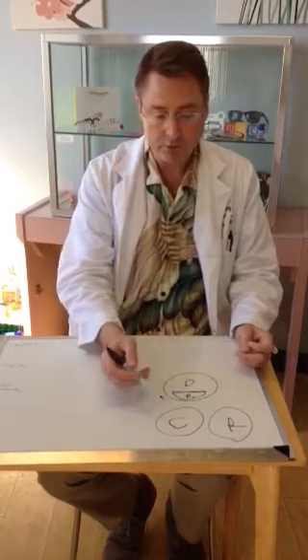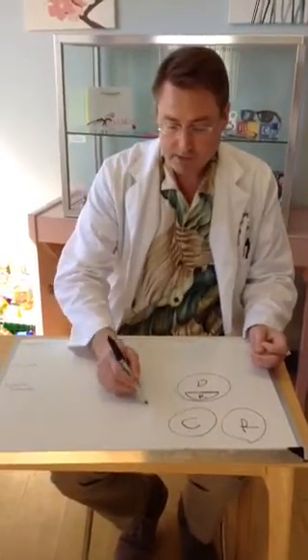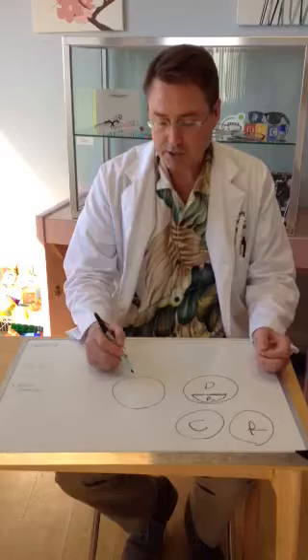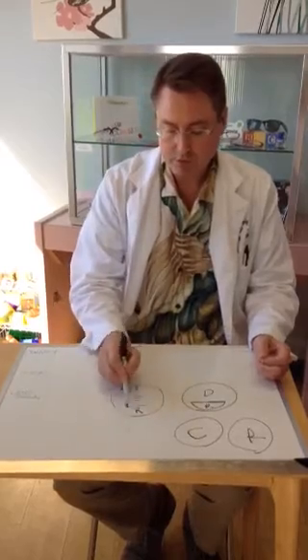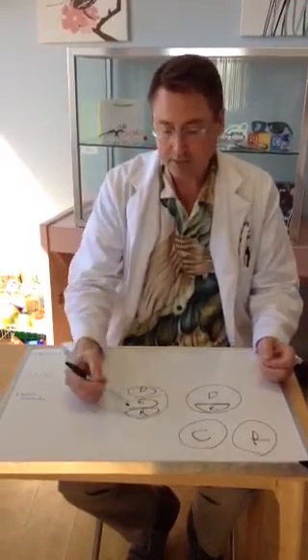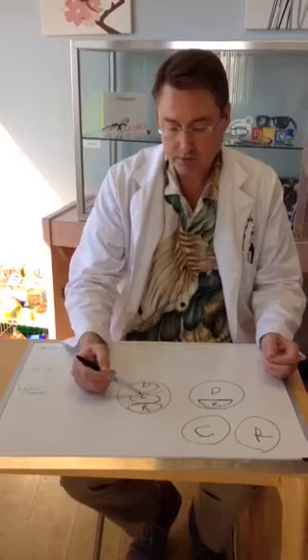Drawback is there's nothing for computer. And cosmetically it's not so nice. So what they did is they came up with a progressive lens. They call it progressive because it changes progressively through the lens from distance to computer to reading. So it's 3 zones, much more like natural vision. Cosmetically it's nicer because there's no line. The idea is a smooth progression of power, distance, computer, and reading.